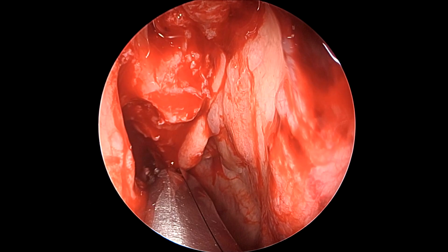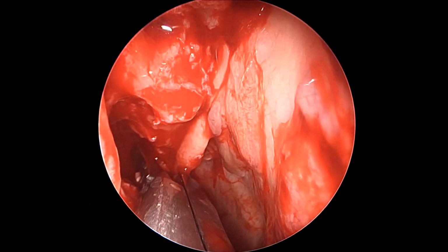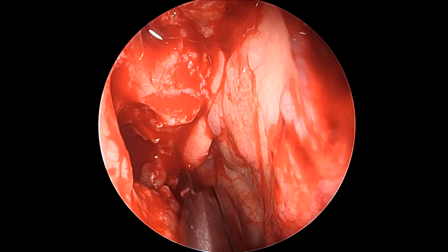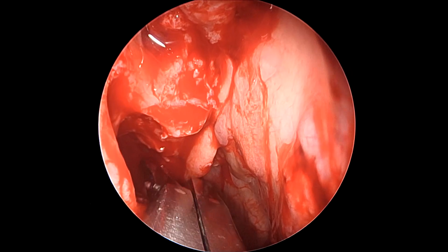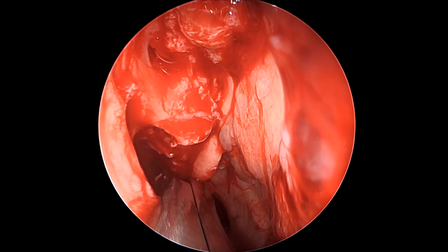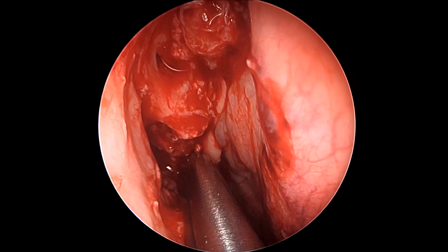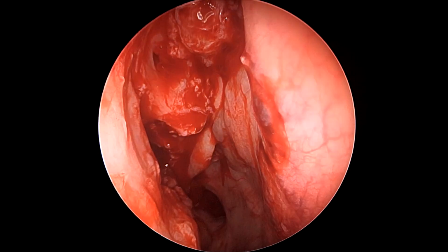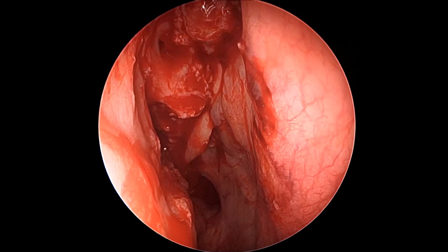A straight biting through-cut instrument or a through-cut forceps could be used to enlarge the antrostomy posteriorly, because anteriorly often there is not much space. However, a word of caution: this must not be taken too far backwards flush with the posterior wall, because that risks injuring the sphenopalatine artery and causing unnecessary bleeding.